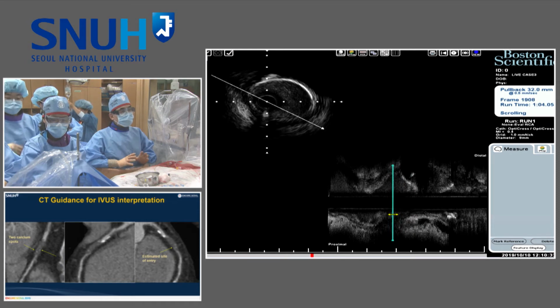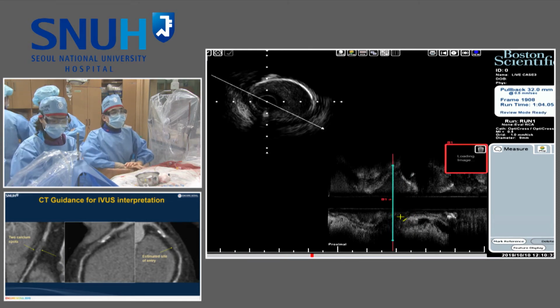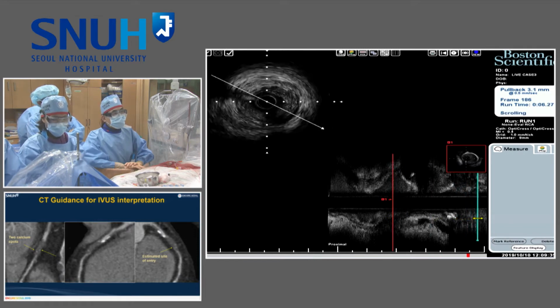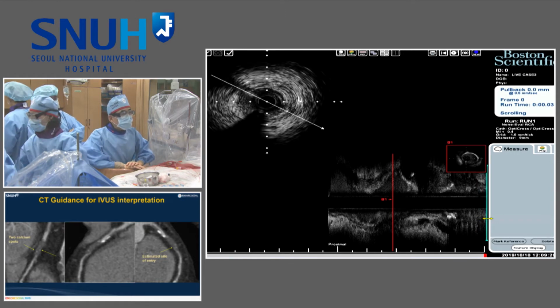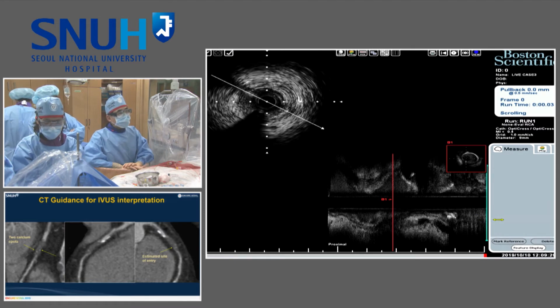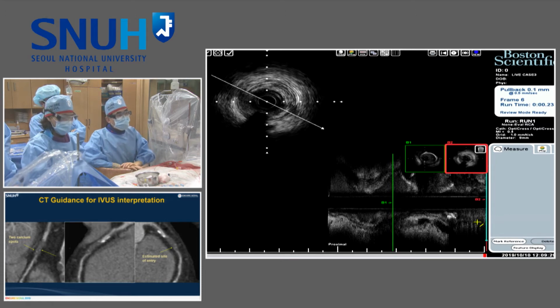With such kind of thin strut stent, I'm sure that 3-month DAPT would be enough in all comers. Thus, this patient is enrolled in HOST-IDEA. Thus, I try to deploy the longest Orsiro, 3.5, from the RCA ostium, just distal to the retrograde microcatheter.